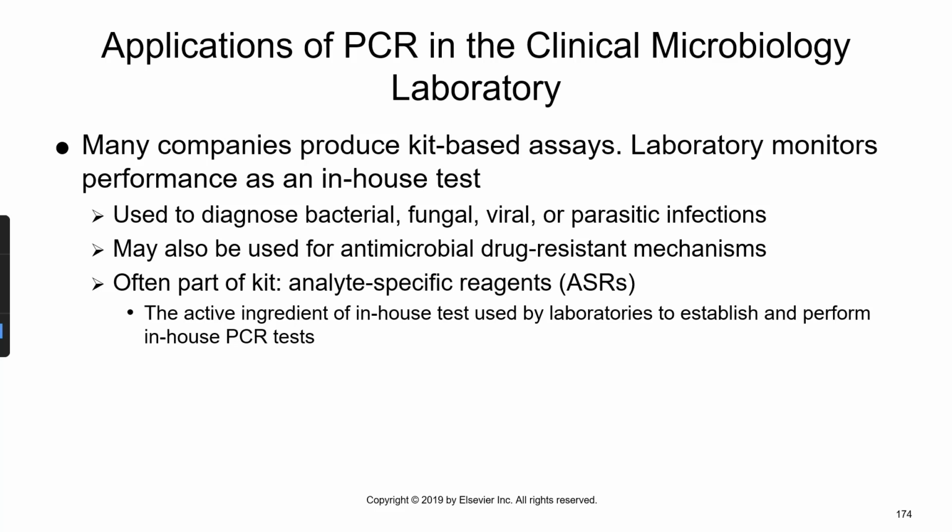Many companies produce kit-based assays, so now when you go work in microbiology, if you are doing a molecular test to diagnose a particular pathogen, you put the patient's sample directly into a cartridge, and then you put it on the analyzer, and it will do everything for you. It will pipette different reagents into the different compartments. You never have to open up the equipment. It's all done internally. It reduces the likelihood of contamination and error because it's all automated. So as the tech, all you do is inject the specimen where it needs to go, put it on the system and press start. And then the system will go through all those steps.